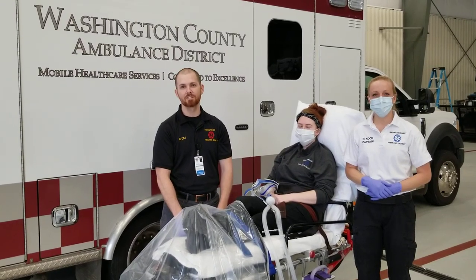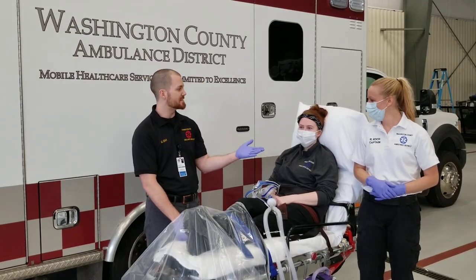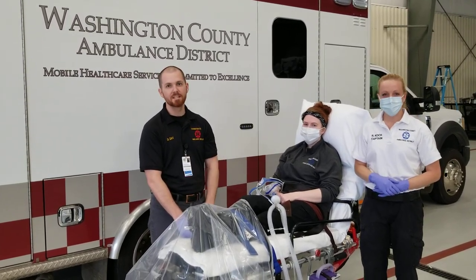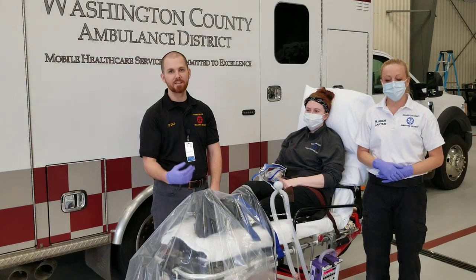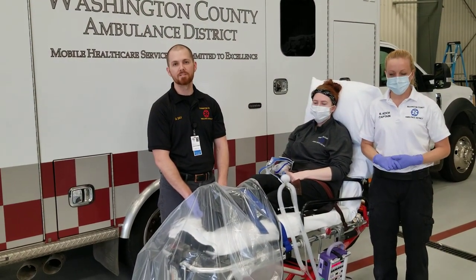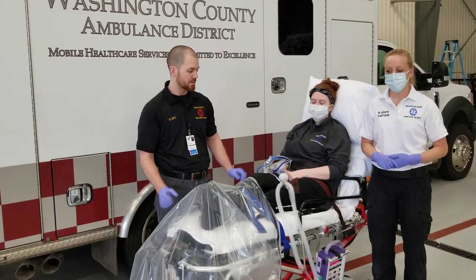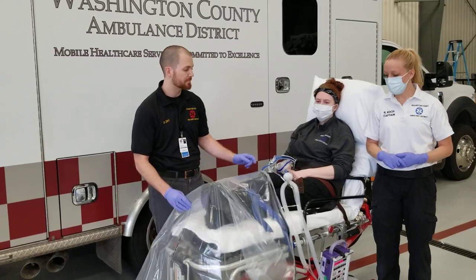I'm the Director of Clinical Services for Washington County Ambulance District. Today, I'm going to be using my assistants, Sarah Shoemake and Rita West, to help demonstrate how, in the event that you have a highly infectious disease patient, you can safely administer non-invasive positive pressure ventilation or nebulizer therapy to them using this barrier device that we've created here.